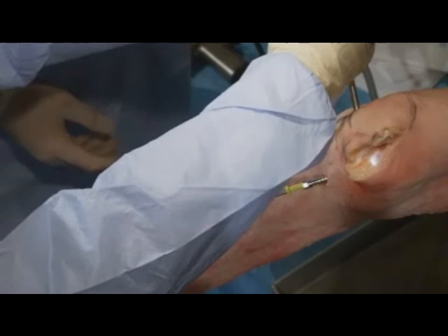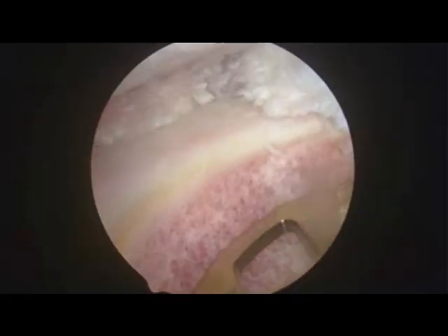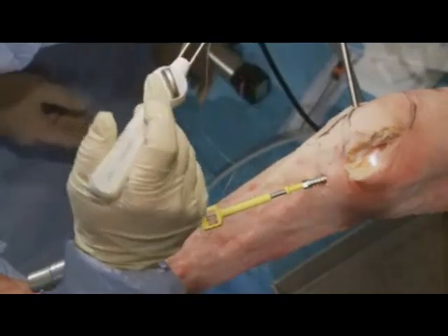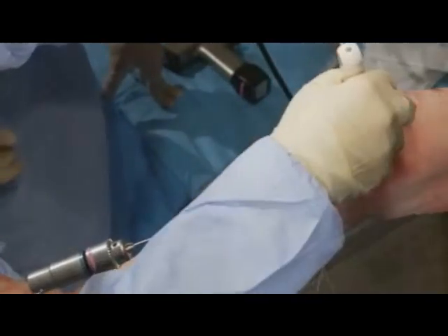You see we're looking at our slot, and you can see that it actually resurfaces a fair amount of the tibia. So this is now our trial guide, and this is a little bit thinner than the regular one, but the thickness of this and the thickness of the blade makes up for the thickness of a real implant. So you see we insert it into position, and we can see that it sits down nice and flush at the back there, and it's actually a fairly congruent fit all the way around.